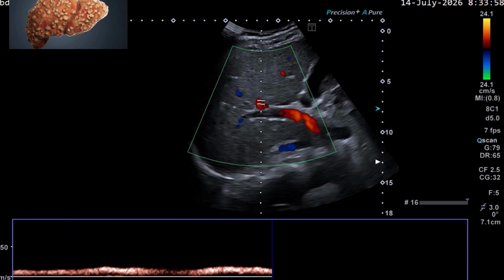So I need your comments, guys. Comment on this type of a liver, or do you think that is normal? Is this a normal occurrence, or is it an aneurysm? If it's a normal occurrence, tell me that it's normal. And if you think that the parenchyma of the liver is normal, let me know that this parenchyma is normal. I am seeing fibrotic changes. I am seeing early signs of fibrosis. So there is hepatic scarring.